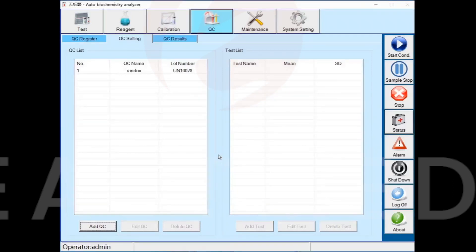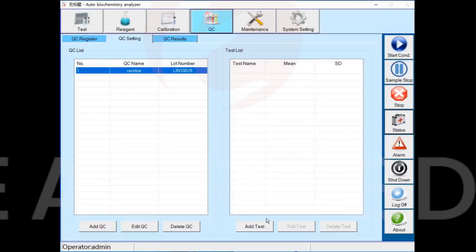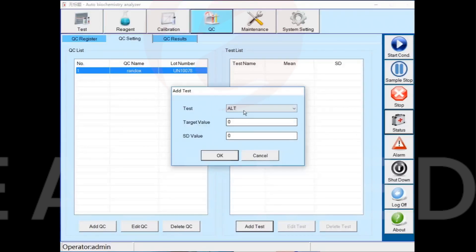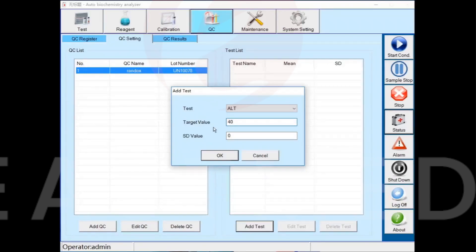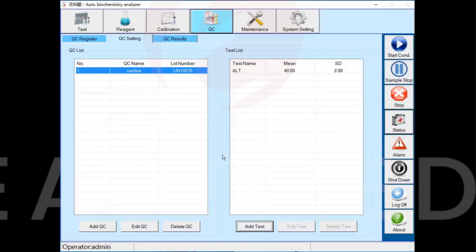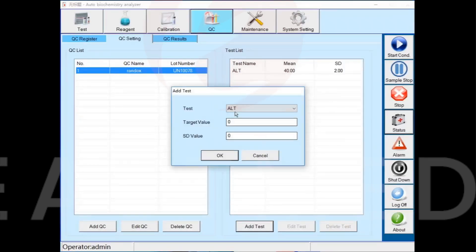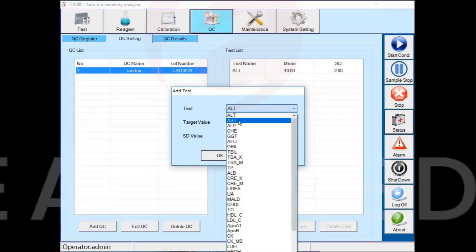Select the newly added QC, add QC analysis name, enter the target value, and enter the standard deviations. Complete all QC analysis names, then enter the QC register interface for quality control registration.